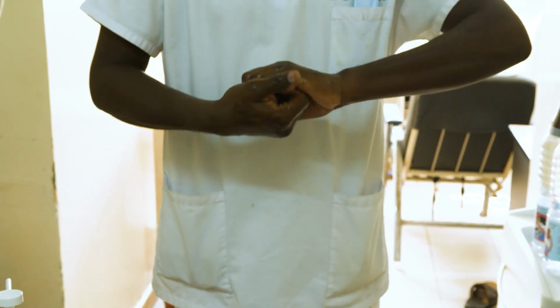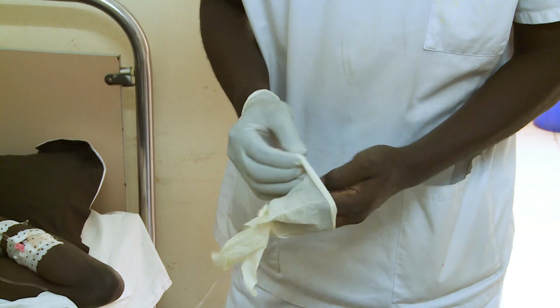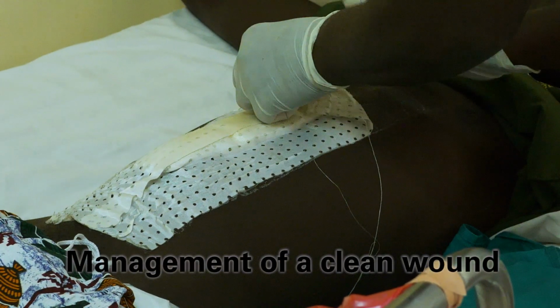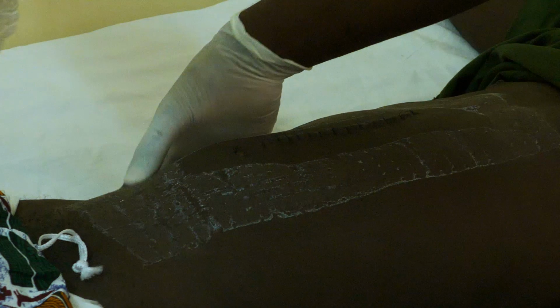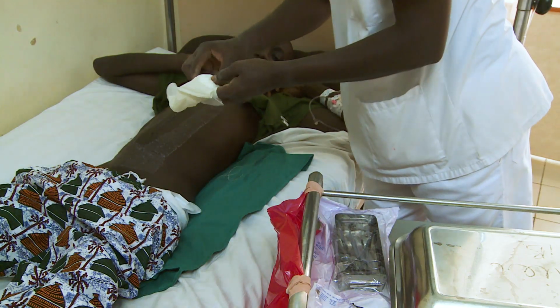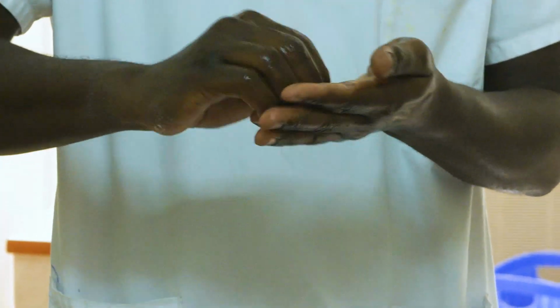Perform hand hygiene before performing a clean aseptic task and don non-sterile gloves. Gently remove the used dressing, careful to avoid touching the wound directly. Dispose of the used dressing and gloves directly in the waste bag. Perform hand hygiene after body fluid exposure risk.